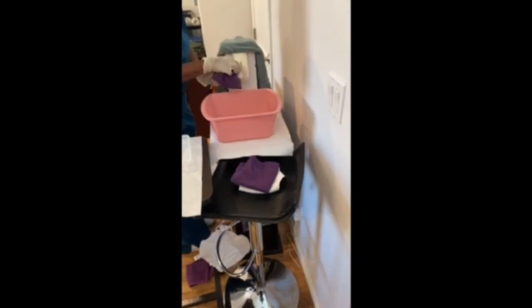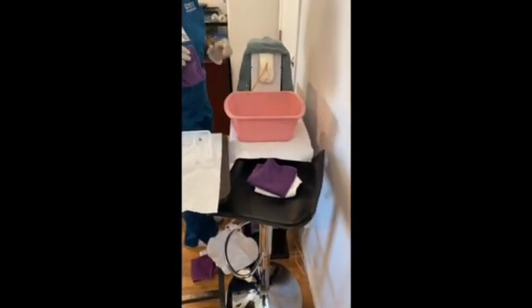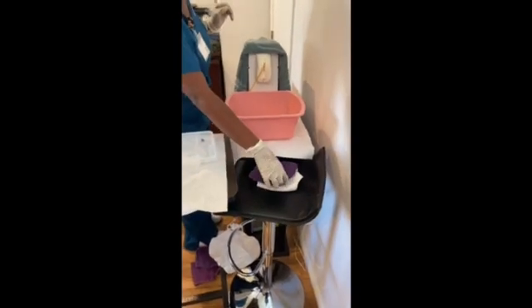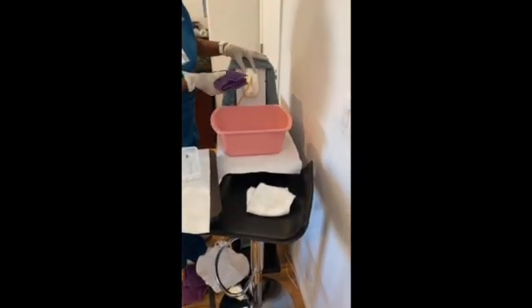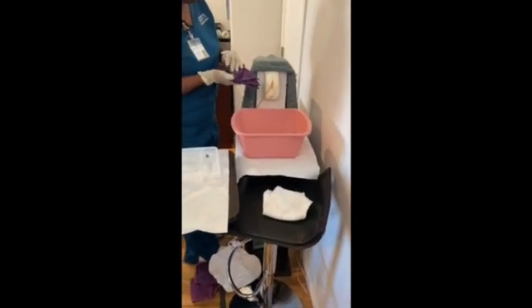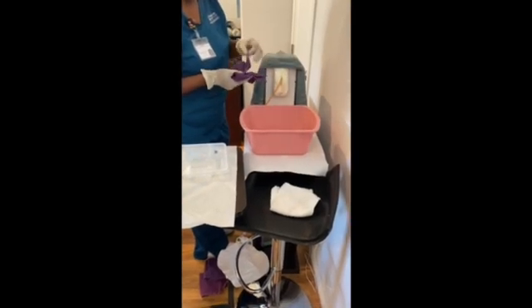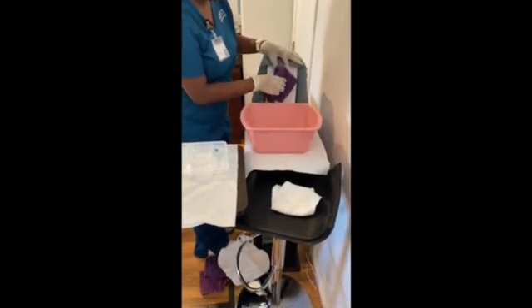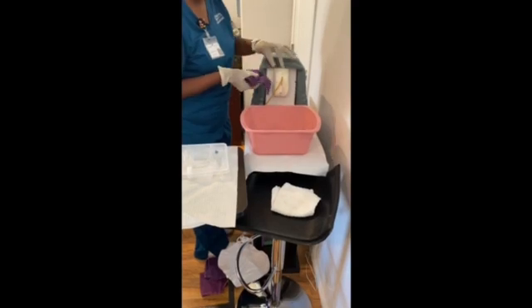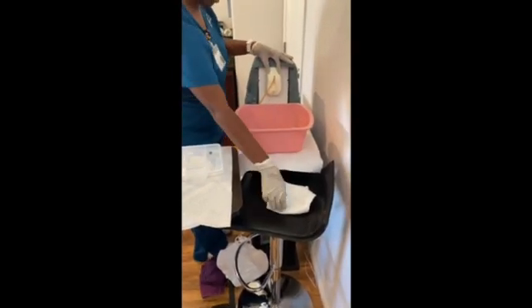I'm just going to snake a little bit down the tube for any lubricant or anything else that got on. That also is in the trash. Now we dry the patient. In the laundry bin.